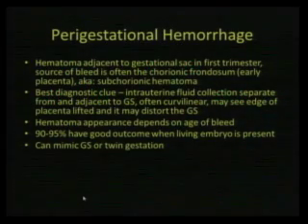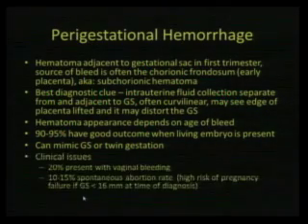And it can mimic a gestational sac or twin gestation. So if you see this, that's kind of in your differential. If you see what you think is two gestational sacs, one of them could potentially be a perigestational hemorrhage.